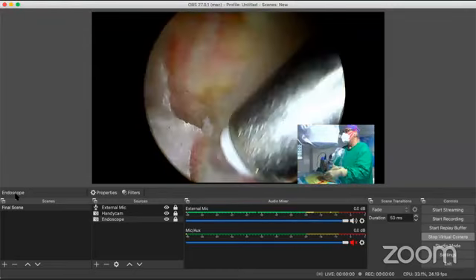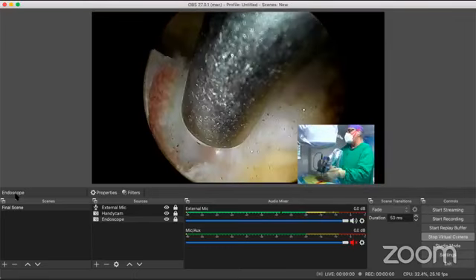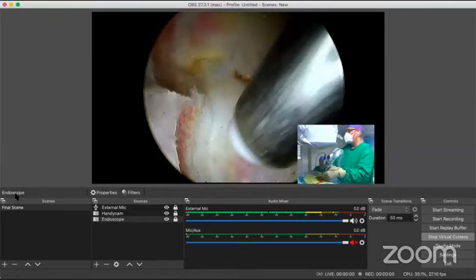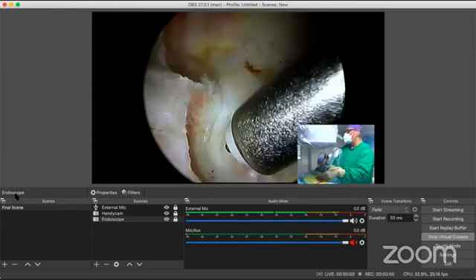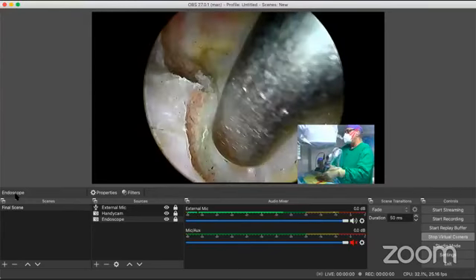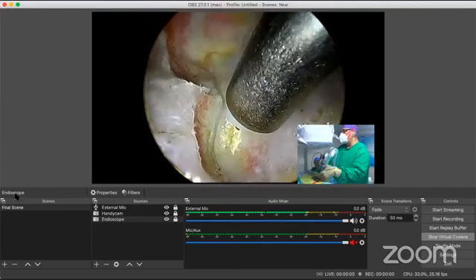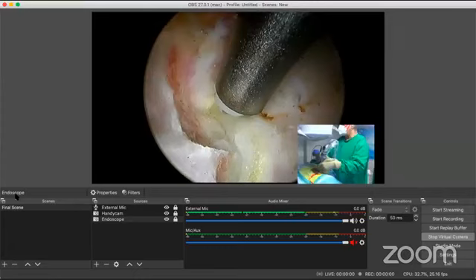Okay, thank you. See, now a little more on this side. Touch here, blue, please. See, this is the lower lamina. This is the lower facet joint. Okay, this is the SAP. This was the IAP. This is the facet joint in between. See, I'm burning the cartilage and the bone, and you can see how much it is overlapping. And this is the original V point.